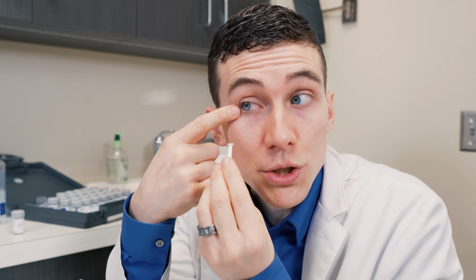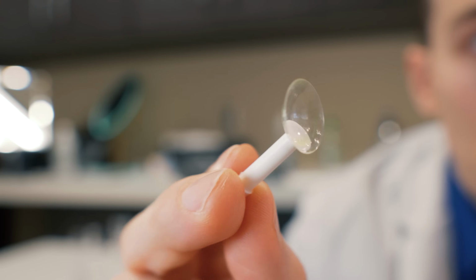At the same time, you can push on the side of the eye, and that'll help break suction from the lens. Try not to put the plunger directly on the center of the eye, otherwise it's going to put too much suction pressure on the eye itself, and it's going to be hard to get off. Again, try to aim for the lower 1/3 of the lens so it acts kind of like a fulcrum and is able to come off much easier. And there, you did it.